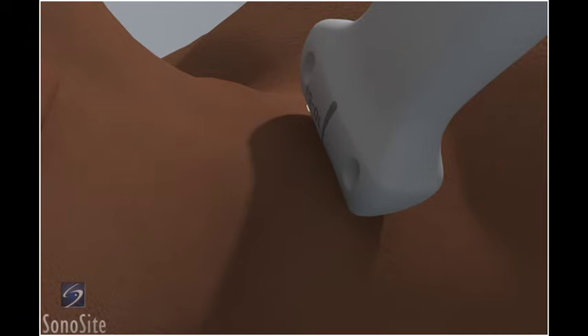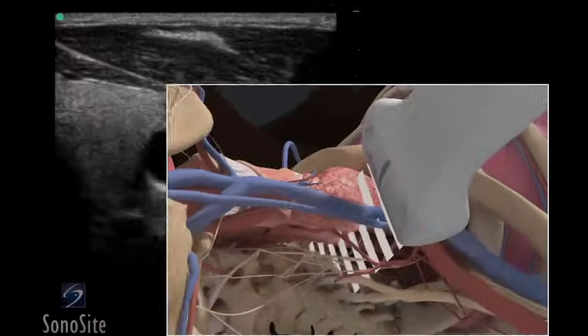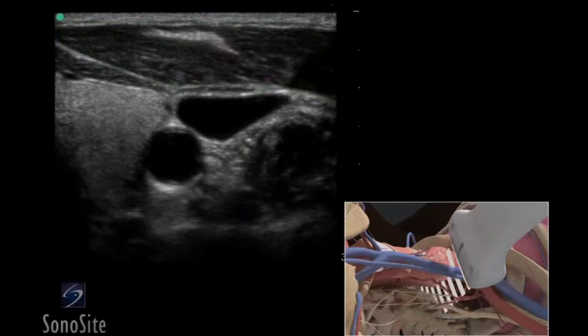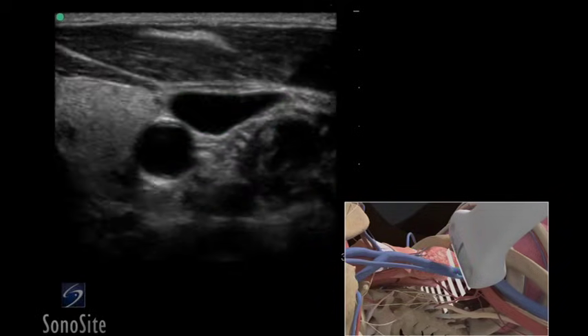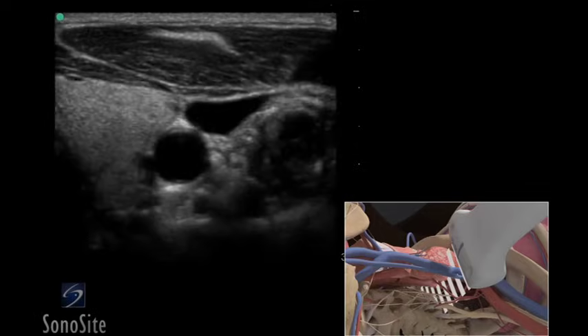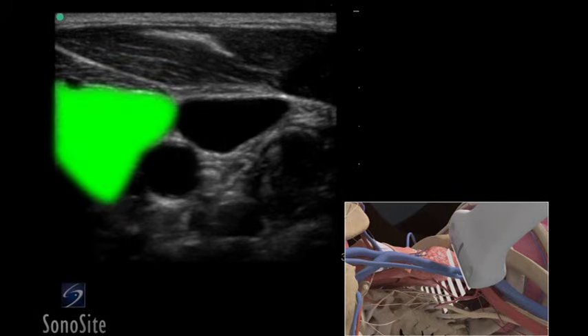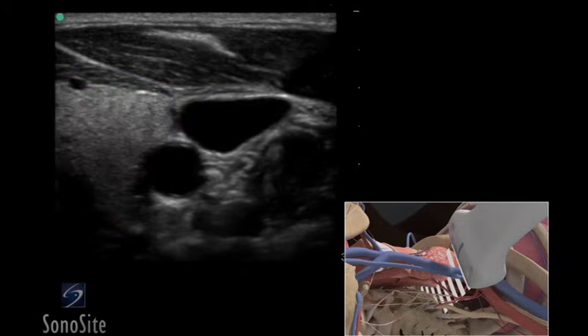The most superficial structure identified in the ultrasound image is the sternocleidomastoid muscle. Deeper to this, the internal jugular vein will appear as a dark anechoic elliptical shape and compressible with transducer pressure. The artery will be circular and pulsatile. The thyroid gland lies medial to these structures and has a light gray echo signature.